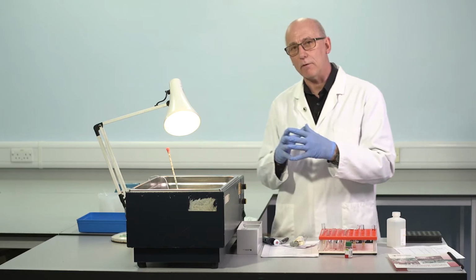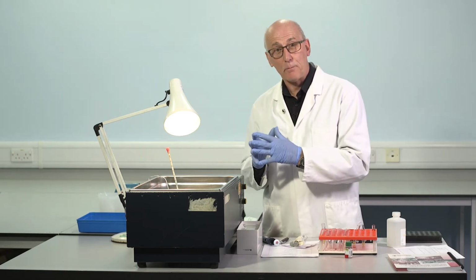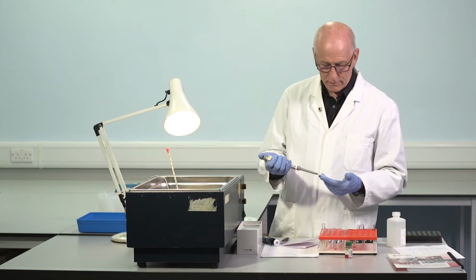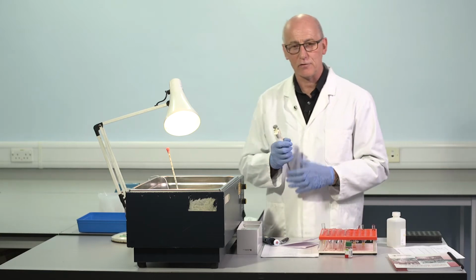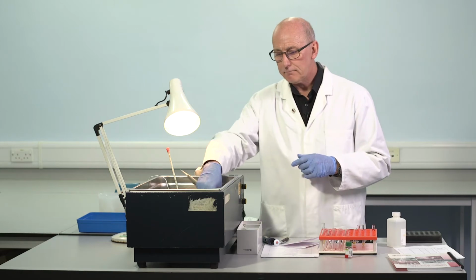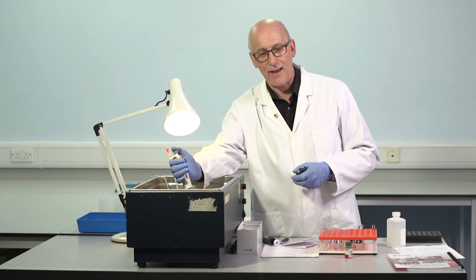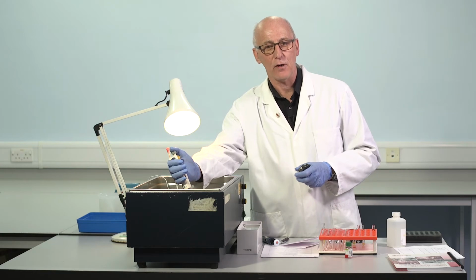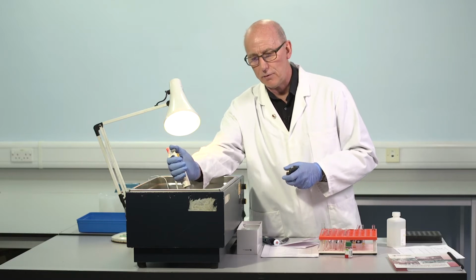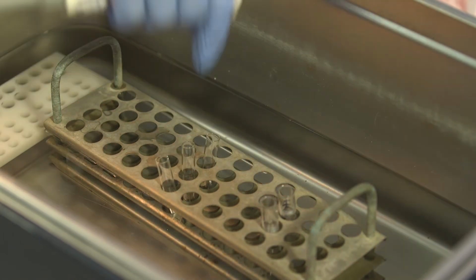Okay, so in the tubes at the moment, factor VIII deficient plasma, 3 different dilutions of standard. We'll effectively be performing now an APTT on each mixture. So we've got the APTT reagent, activator, phospholipid. You know that there are many different activators present in APTT reagents, sometimes kaolin, sometimes ellagic acid, sometimes micronized silica. This can have an influence on the results. It's particularly important, or will have a particularly important effect in samples which contain some of the new extended half-life products which are coming through to market now and in the future. So I think this will be increasingly an important piece of information to be aware of in relation to APTT reagents. So we add APTT reagent to the first tube and mix.